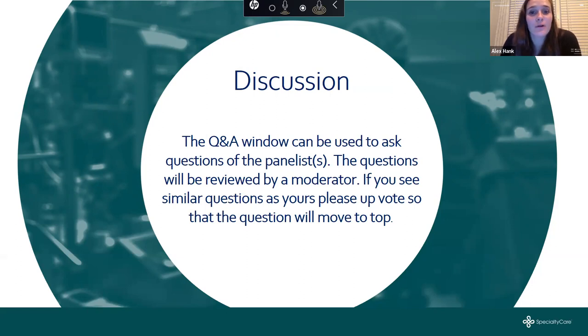We had a follow-up from Maureen Gray. Akif, she said, as in ECMO cases, a distal perfuser is sometimes used to decrease the pressure drops. Perhaps a line off the aortic cannula to another peripheral site would decrease the pressure drop at the tip, preserving pulsatility a bit more. Yes or no, do you agree? I don't have experience, so I cannot say yes or no. I'm sorry, because I don't have the data. If I have the data, then we can discuss it, but I wouldn't change anything in clinical practice just to generate better pulsatile flow.